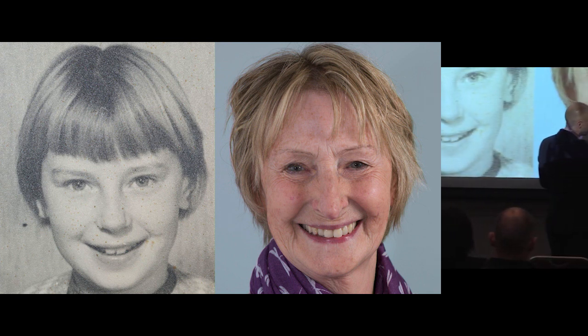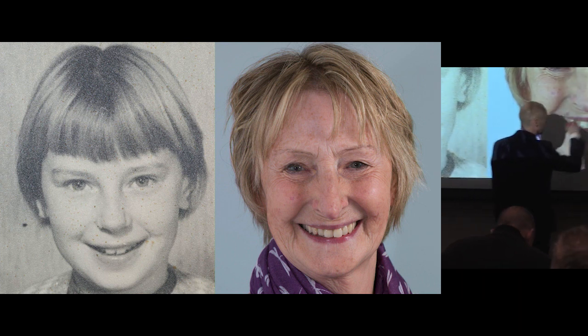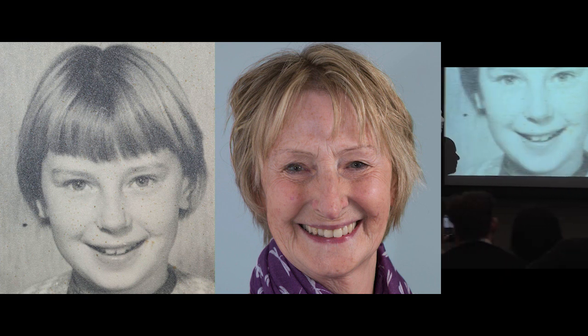And that's what he did for Julie here. You can see that he's brought this central forward, this central's back a bit, proportionally to the right size of teeth. I'll be talking about how to calculate the right size of teeth. So there's a bit of movement in there, and as we've learnt this technique, we've had to be really brave with our tooth positions and actually not do it according to the textbook. It's just like, let's do it like nature, you know, natural teeth.